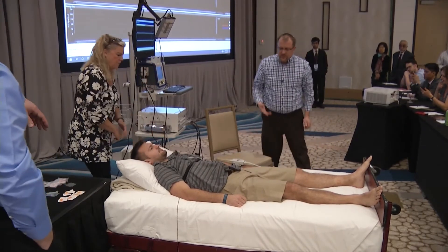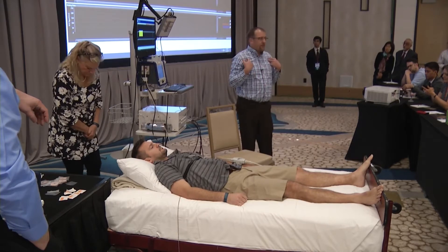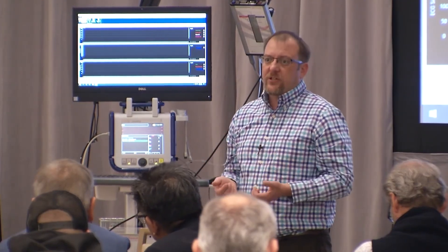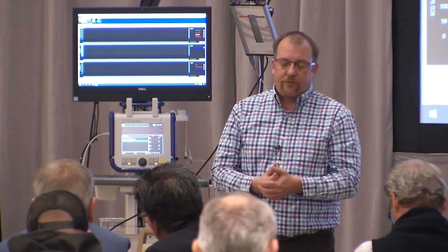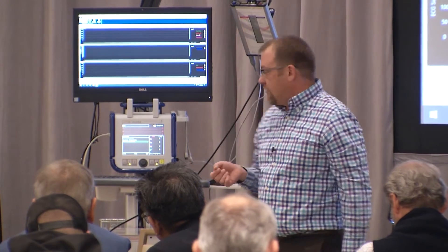We still like to use a standard three-lead ECG. There are some ECG devices now that are four leads and will automatically switch to the best lead selection. If that's something you have, feel free to use it, but we like to be able to manually adjust that as we want to.